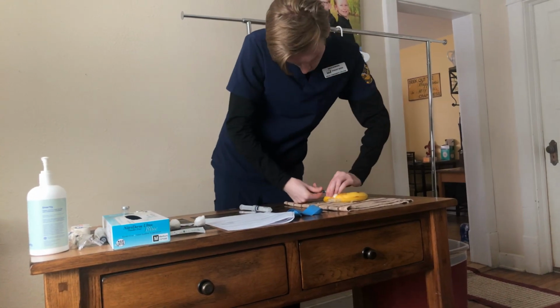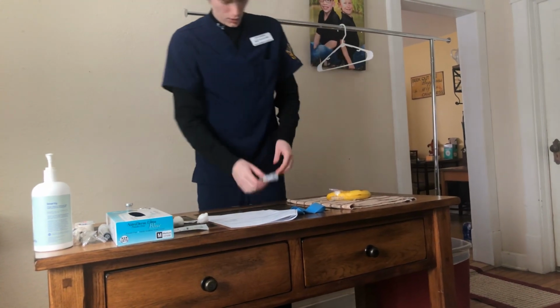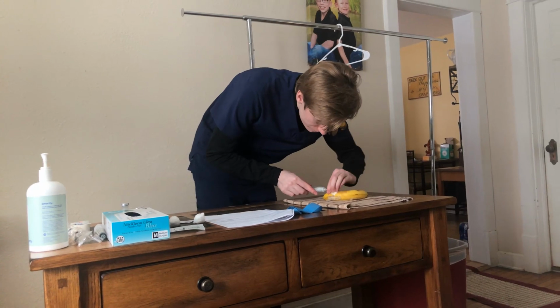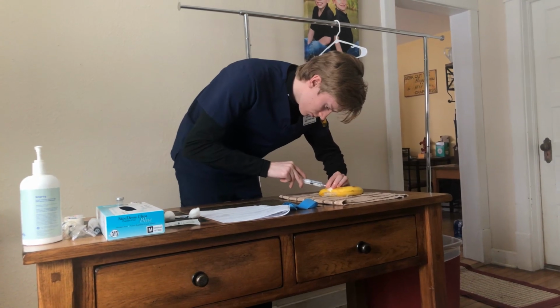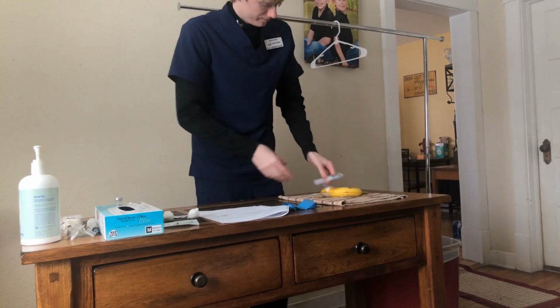Perfect. Now that that's done, discard these in the sharps container. And flush again with 5 mils of saline. Perfect.